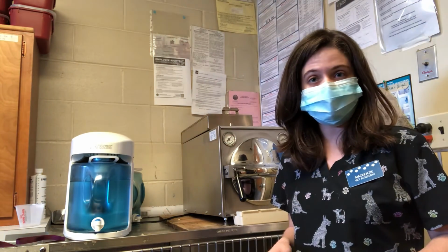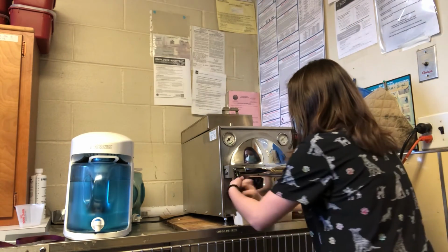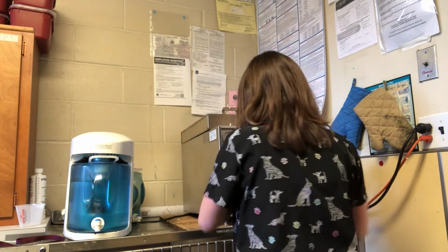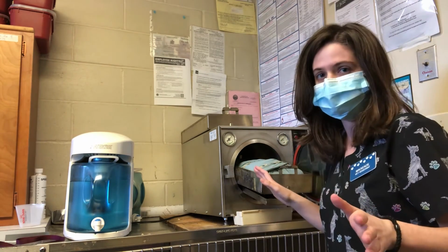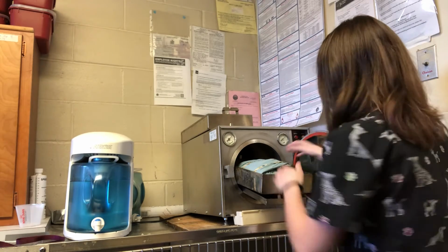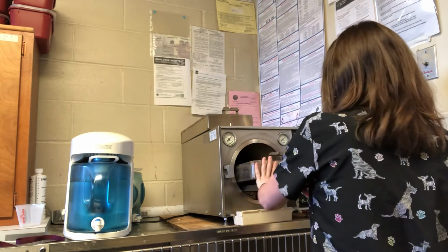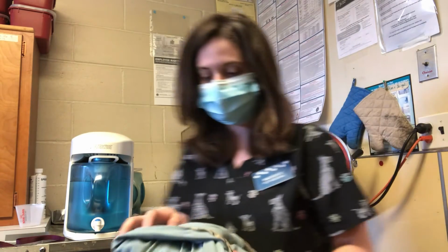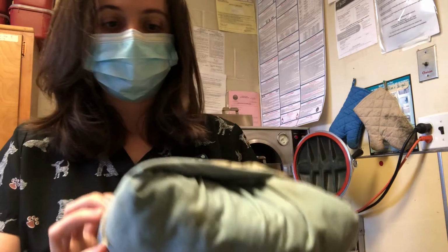So now that our pack has finished being sterilized in the autoclave, we can go ahead and open it up. And we've allowed it to sit for a while so that it can cool down so it's not hot to the touch. And as you can see, we have our indicator tape here. The black bars indicate that it has been sterilized properly.